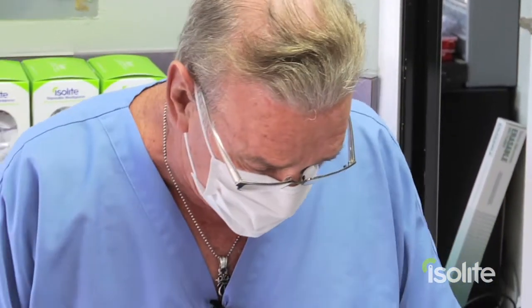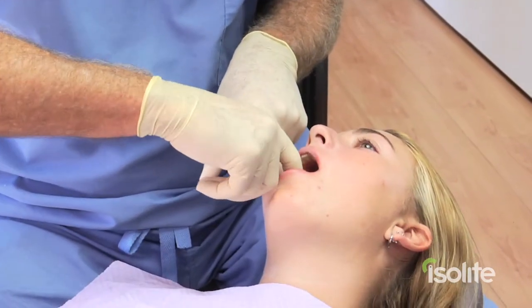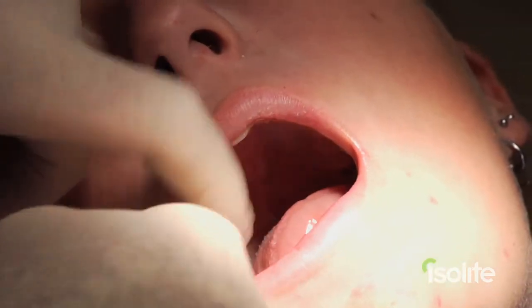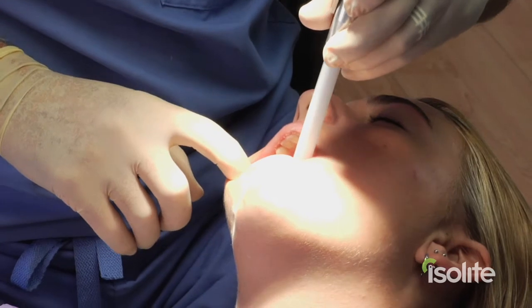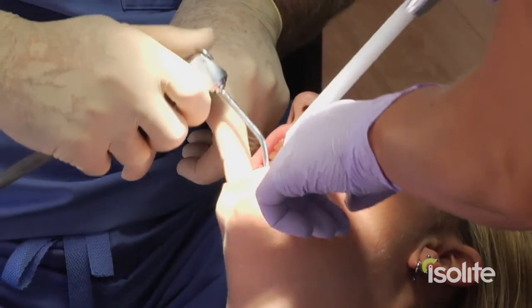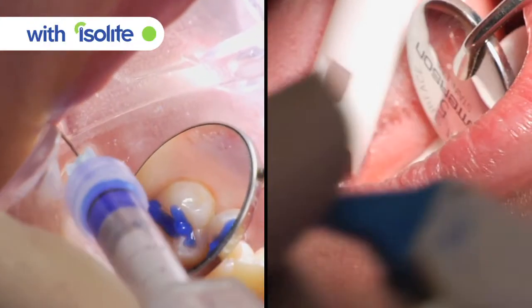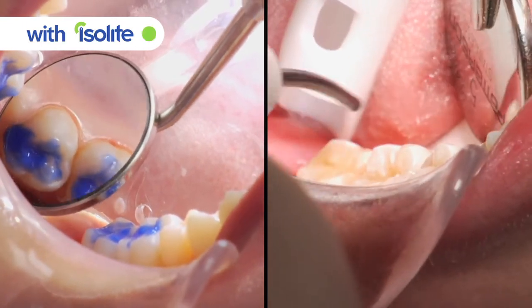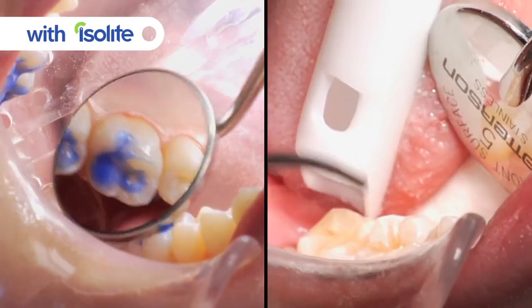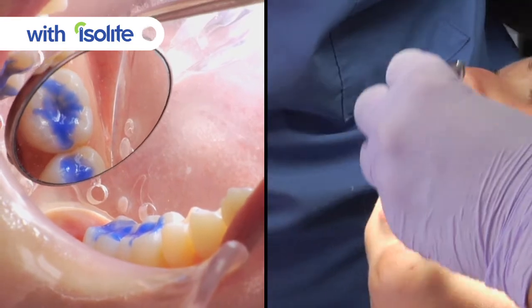We're going to compare and contrast right now to cotton roll isolation. With cotton rolls, I would only be able to do one quadrant at the same time. Just look at all the moisture contamination way back there. You're going to need a high-speed evacuator and cotton rolls, and the lighting itself is just tough. My assistant will absolutely have to help me. I'm fighting cotton rolls and cheek. You can really only do these two teeth at the same time, and it's just a lot more cumbersome. Then I'd have to go up to the upper, take out all the cotton rolls, and do the other side. It's just that much harder.